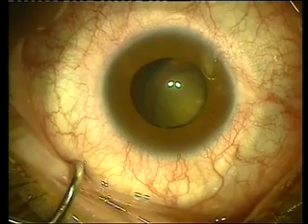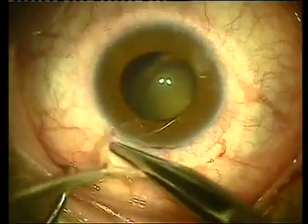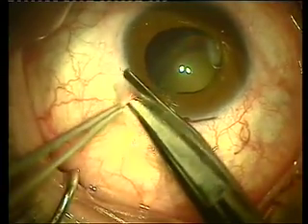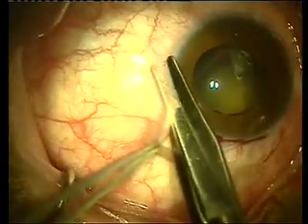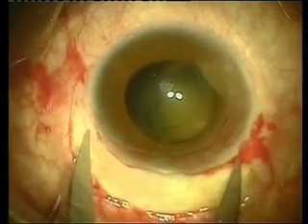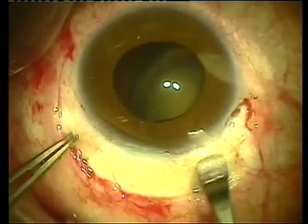Here we're seeing another case of severely subluxated lens that has developed into a cataract secondary to an old accident. We are going to remove this lens via an extracapsular cataract extraction procedure. The patient is treated here under general anesthesia. We're performing our conjunctival peritomy and a large corneoscleral incision — we're measuring 11 millimeters here.